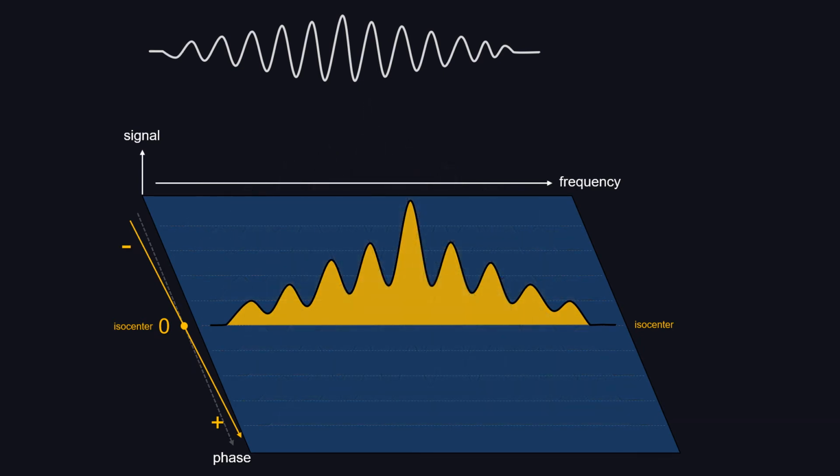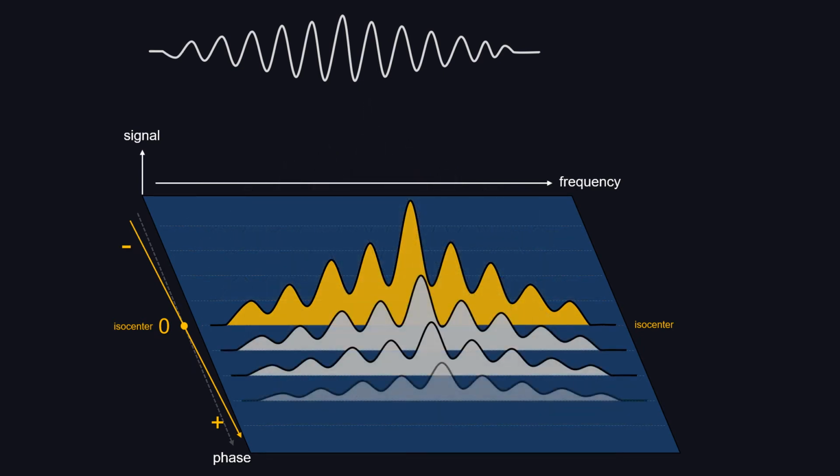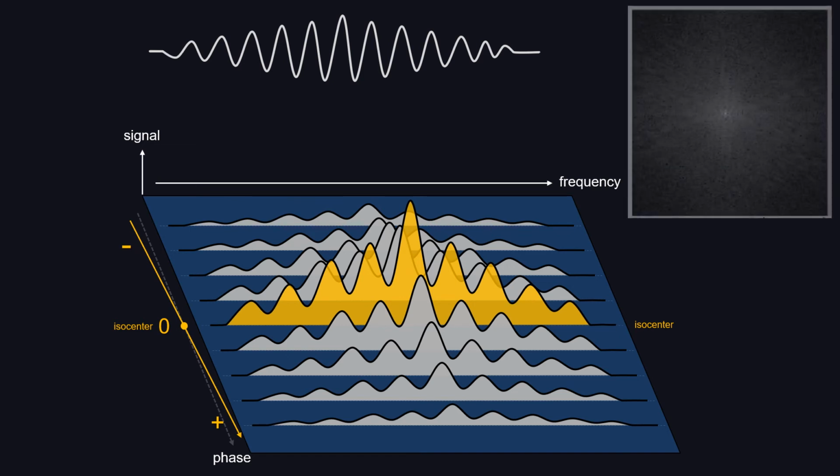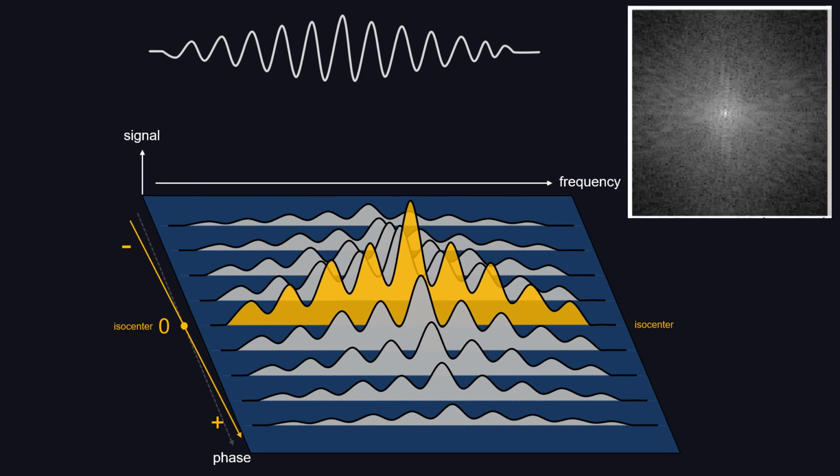As you're getting further and further away from the center, protons become more and more out of phase as the gradient increases. So toward the edge, you see this group has the lower signal magnitude. And in the negative gradient, you see exactly the same profile. Further away from the isocenter, more phase shift they will experience, and therefore more signal magnitude loss they will experience.